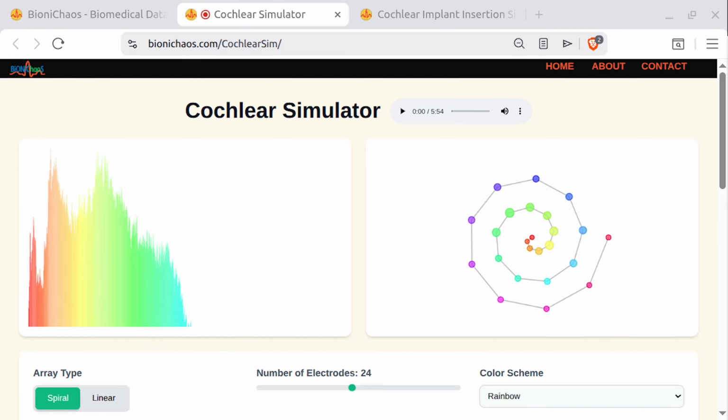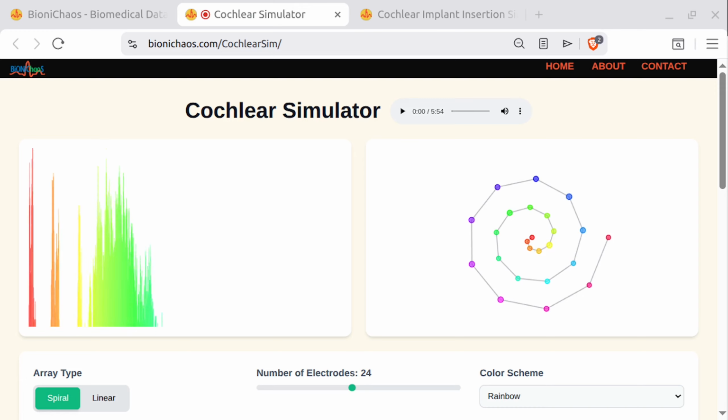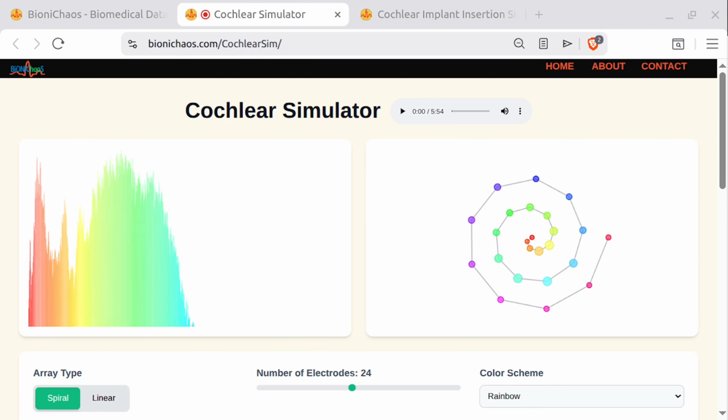However, when I look at the trajectory of the technology, the rotating magnets that allow for MRIs, the flexible arrays protecting the cochlear walls, and the phenomenon of residual inhibition actually rewiring the brain to alleviate tinnitus, the ability to physically restore a lost sense remains a staggering medical triumph. It is a triumph of engineering, yes. It is a calculated risk that for the vast majority of my patients overwhelmingly pays off in human connection.